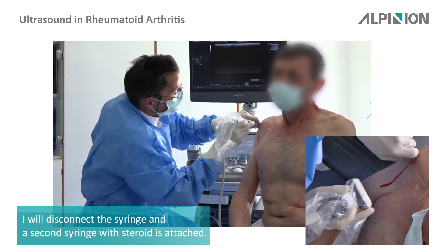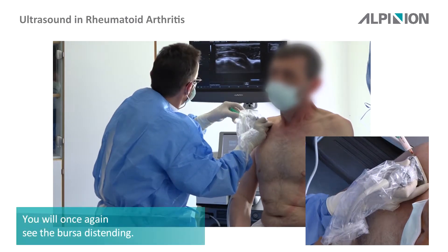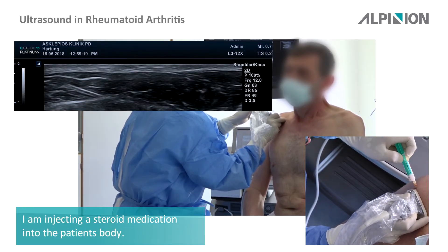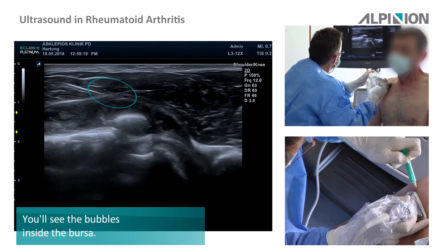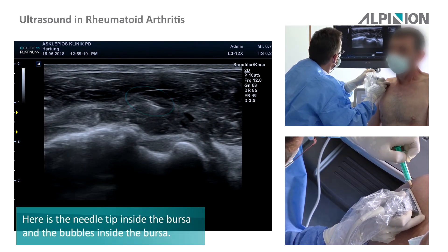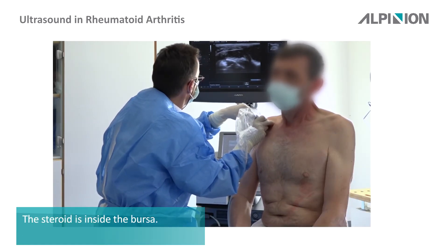So I disconnect it, and now you see once again the bursa is distending. The needle tip is visible, and you see the bubbles inside the bursa — here's the needle tip inside the bursa and the bubbles inside the bursa. So the steroid is inside the bursa.